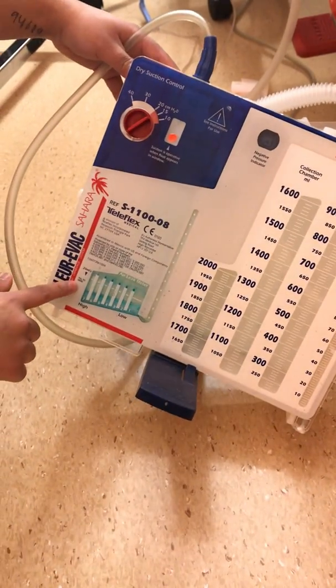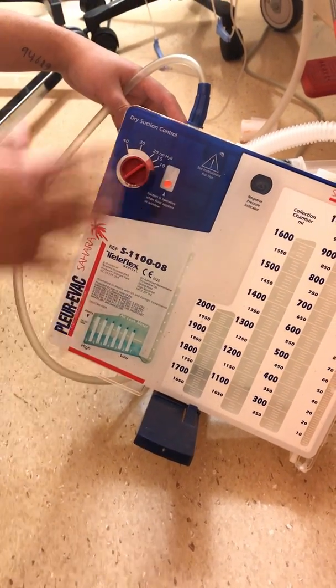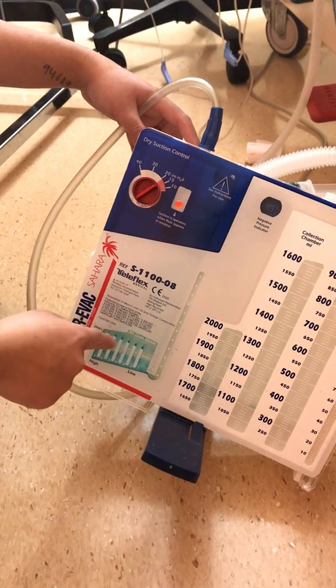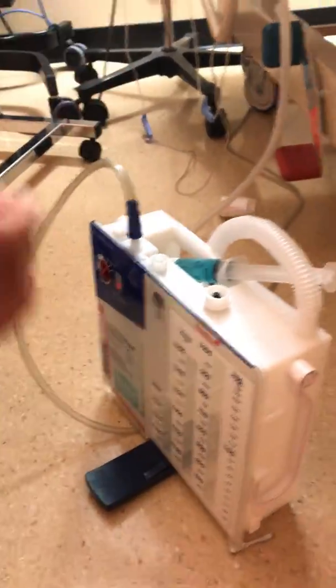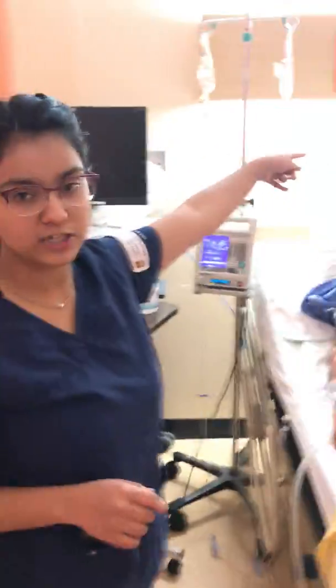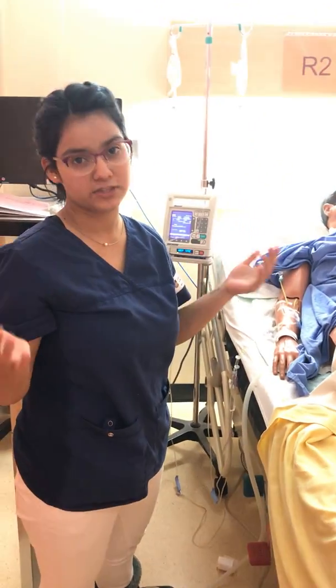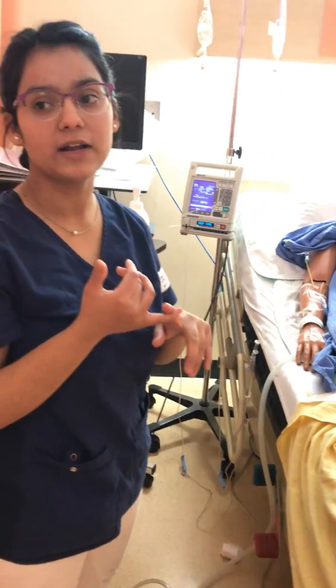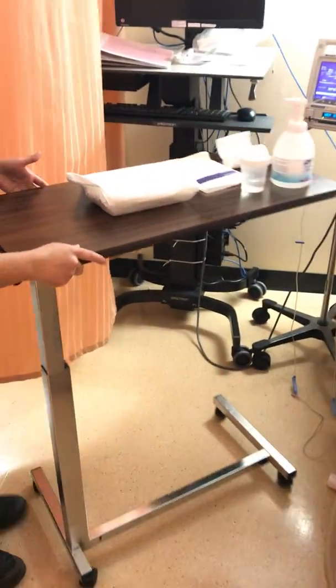We're going to go down here to our air leak chamber. This should be tidaling and oscillating with my patient's breath. If I notice any continuous bubbling or jacuzzi bubbling, that would indicate an air leak. For that, I would take my 2 clamps, go in continuous intervals to look for where the air leak is, and then notify the physician. At the bedside, you would also want to have 2 forceps clamps, normal saline, and gauze for your emergency supplies. Now that we have done that, we're going to start off with our dressing.